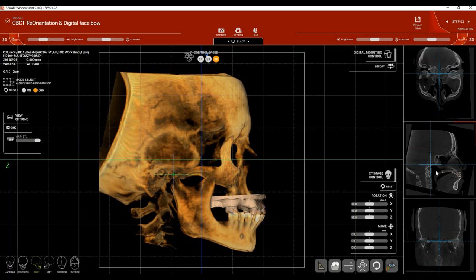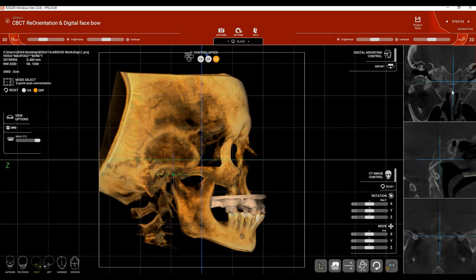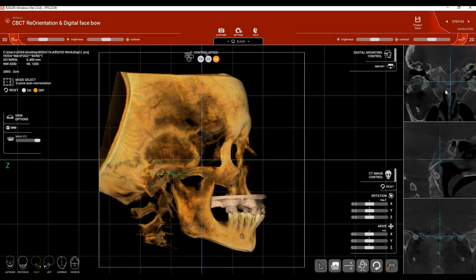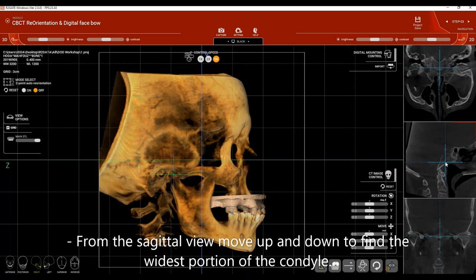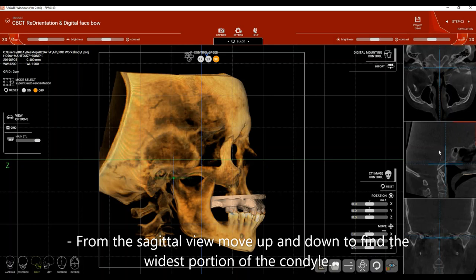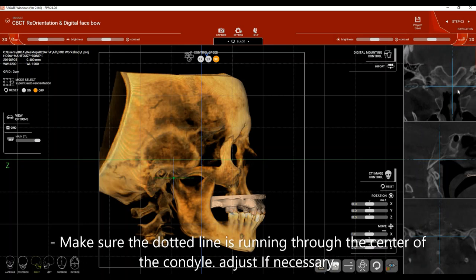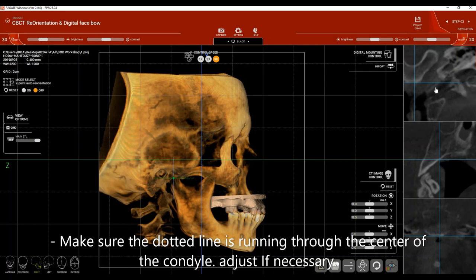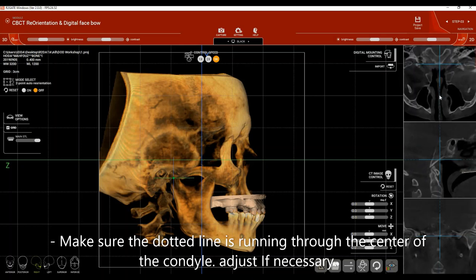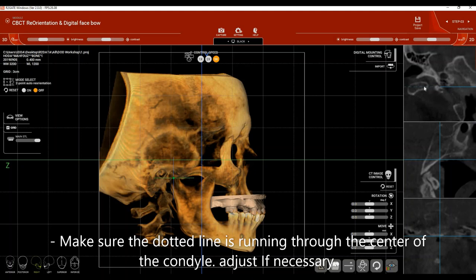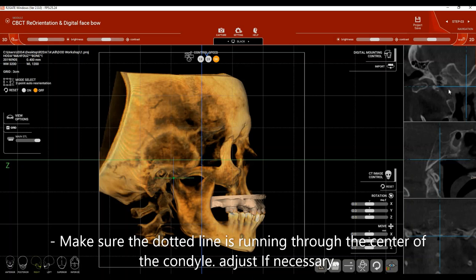For ideal digital face bow placement, position the cross at the widest portion of the condyle. To find this, move your mouse to the sagittal view and move up and down while watching the axial view. Ensure the dotted line cuts through the center of the condyle; if not, use the keyboard to move it forward or back.